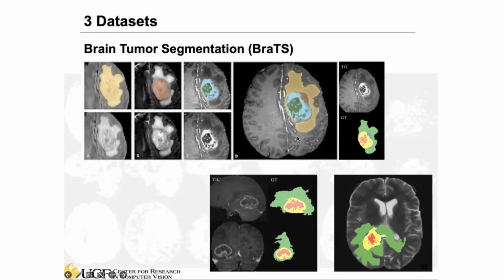We have the T1 weighted, T2 weighted, FLAIR, right? As we mentioned, they correspond to different sequences of the MR images. Essentially, when you process the data, you can consider them as channels, like RGB, you have red, green, and blue. Here you have 3 or 4 sequences. You can consider them as different channels to process. Okay.